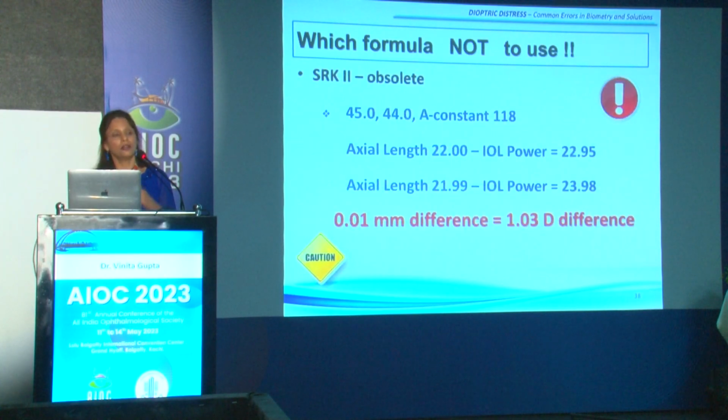But remember not to use this. You can use any IOL formulas. I'll be talking on the next talk about optimization, but what is most important is not to use SRK2. Please, this is an obsolete formula, don't use this.